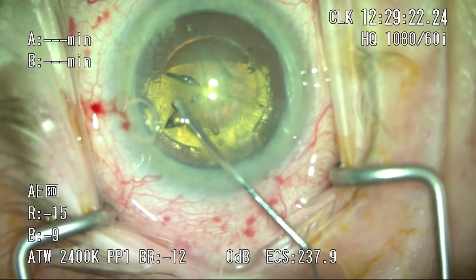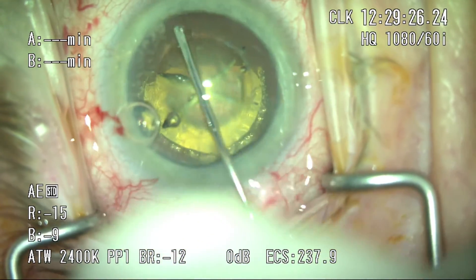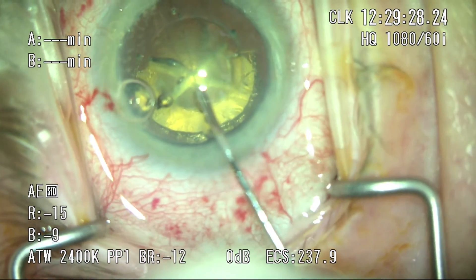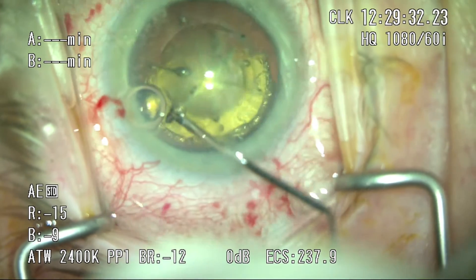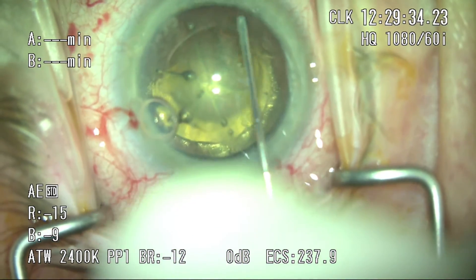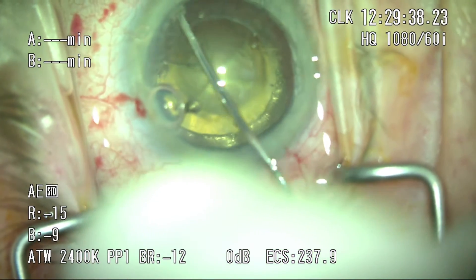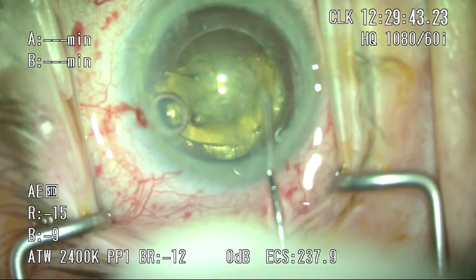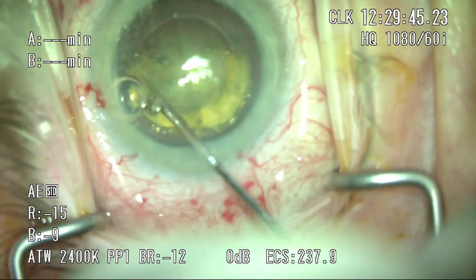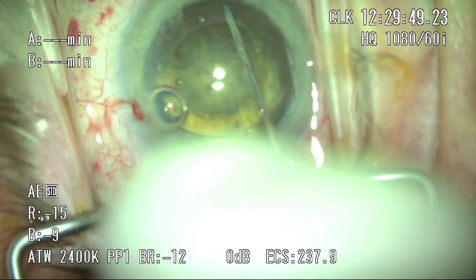In the next step with hydrodissection, I'm typically very aggressive, but here, because of the intralenticular bubble, I proceed very cautiously because I'm concerned about overpressurizing the capsular bag and creating a blowout of the posterior capsule — this has been reported by some femto users. I continue to gently hydrodissect, adding a little more BSS and gently rocking the lens. Eventually, the bubbles come around and you can see them moving forward into the anterior chamber.